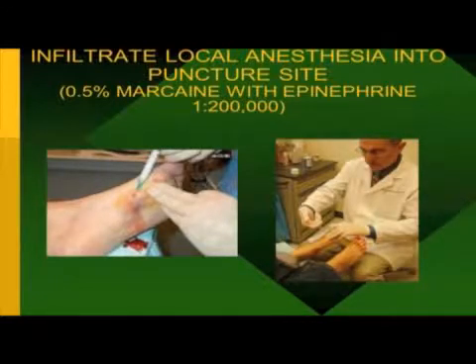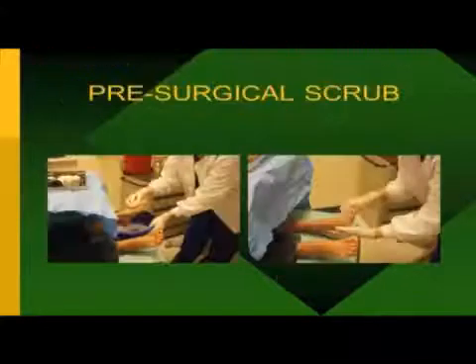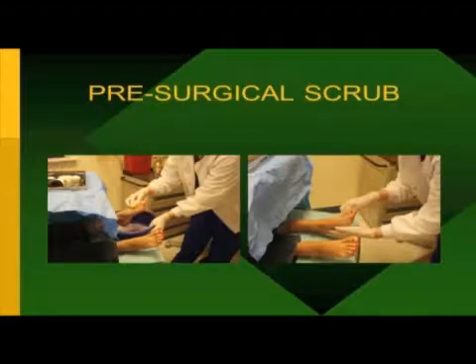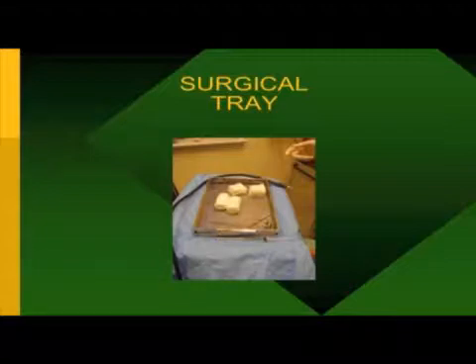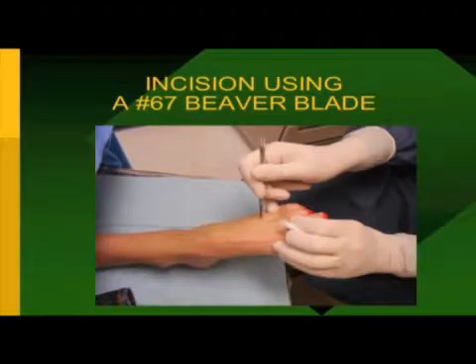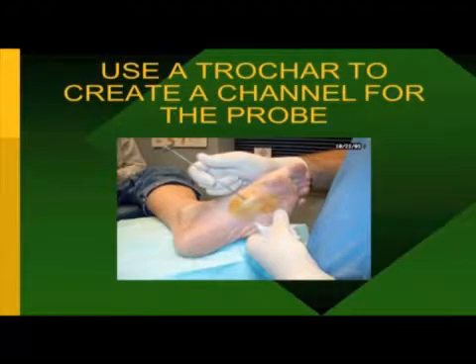The trocar is then inserted. Basically, this is the fibroma — you're actually needling the fibroma, opening it up so you can get your cryoprobe into it and cause freezing. When you have a fibroma as large as this particular patient's, I did two freezes centrally, two freezes distally, and two freezes proximally. Then the cryoprobe is actually inserted into the area. You can see already how much softer the actual lesion has become just from the needling with the trocar.